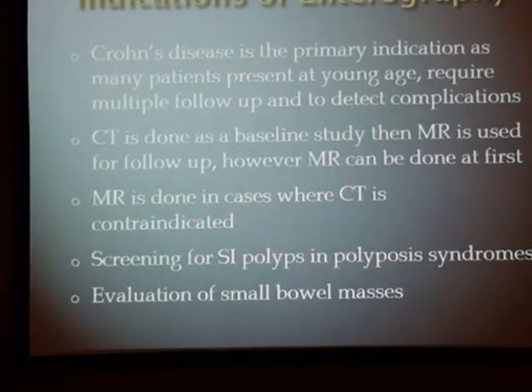Indications of enterography, either CT or MR. Crohn's disease is the primary indication, as many patients present at young age, require multiple follow-up, and also to detect complications. CT is done as a baseline study, then MR is used for follow-up. However, MR can be done at first.